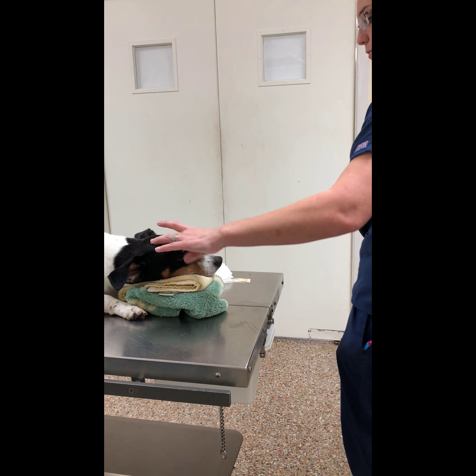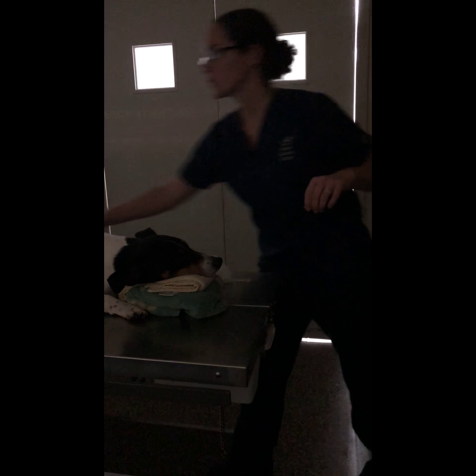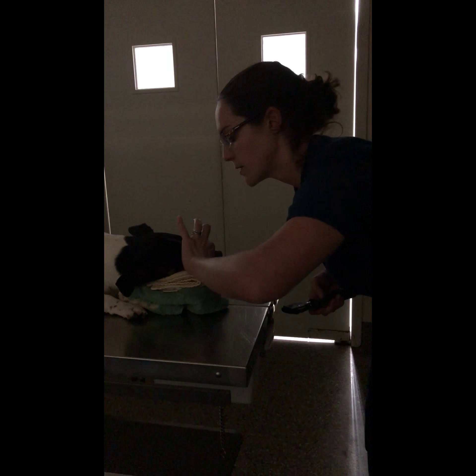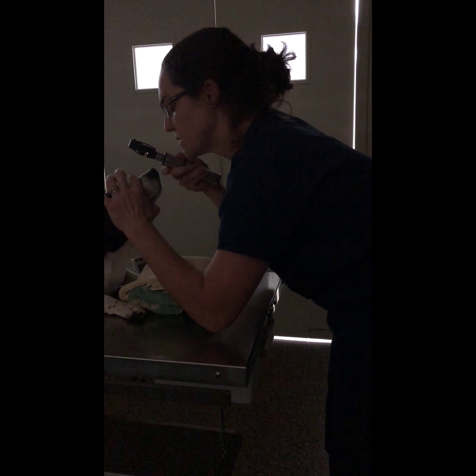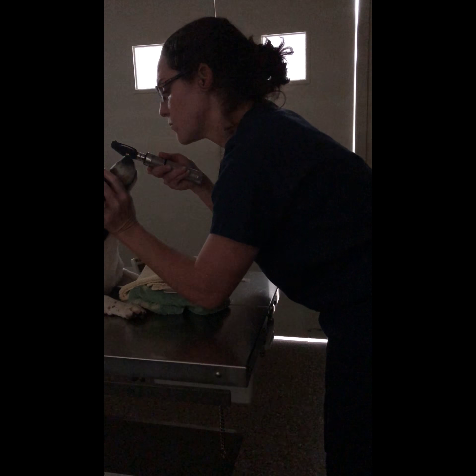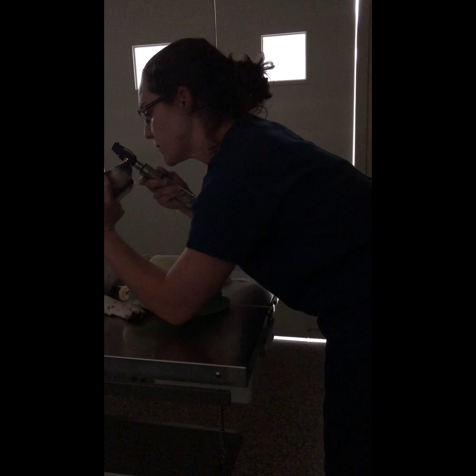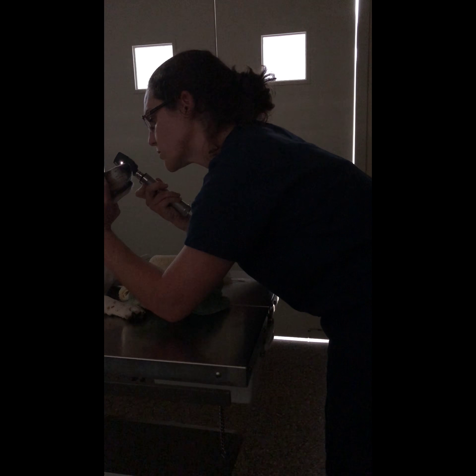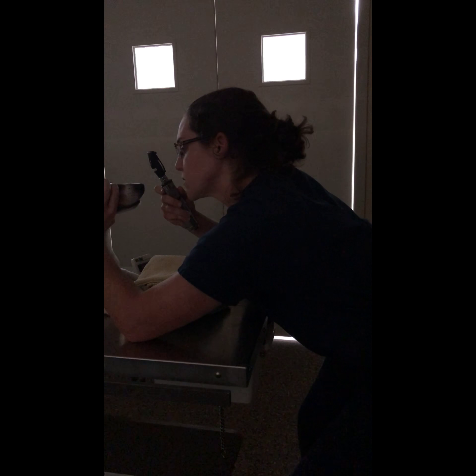I'm going to turn the light off real quick. What I'm looking for is, if there's an ulcer on the cornea, it will take in that stain. I'm just double checking to make sure that it doesn't look like we have an ulcer on the cornea — which it doesn't, because the eye looks good.